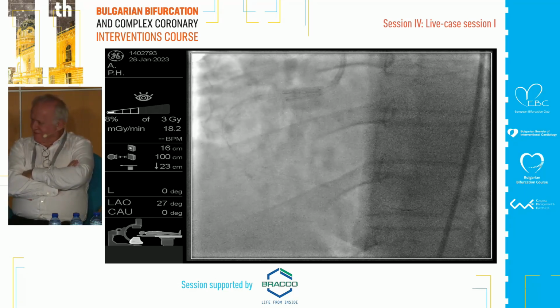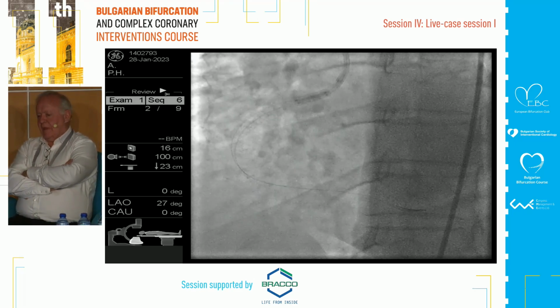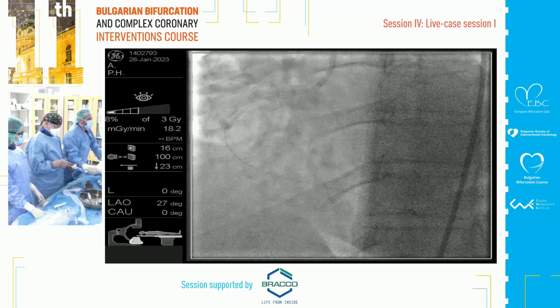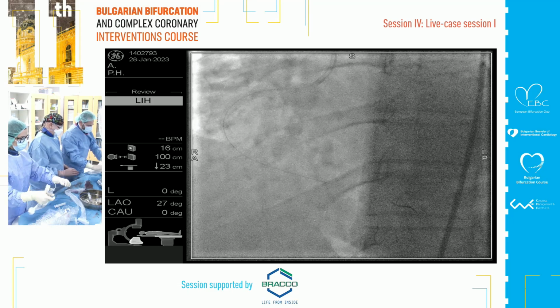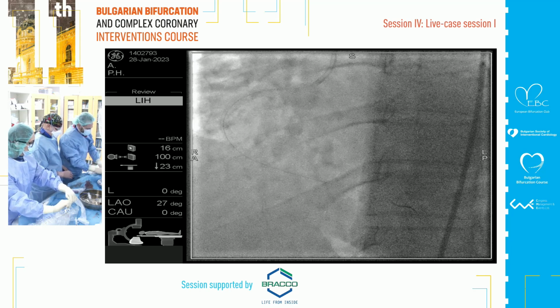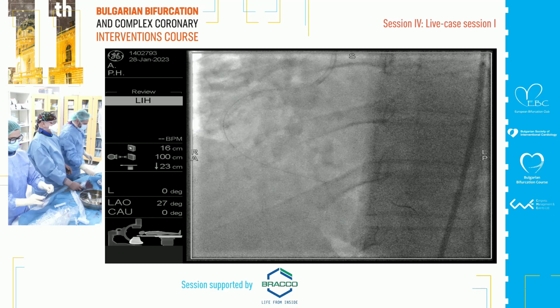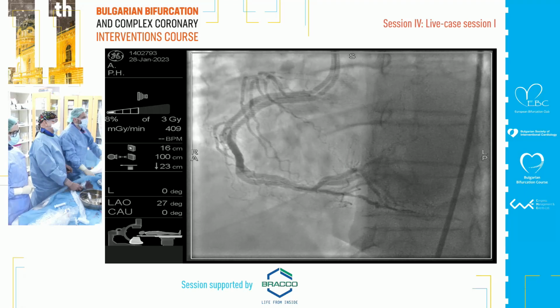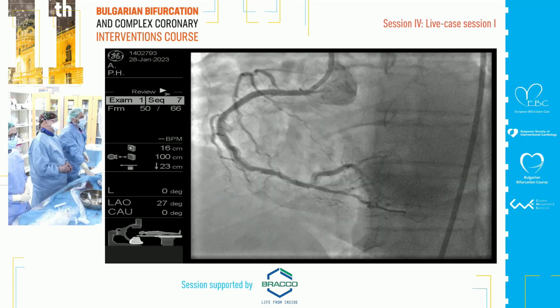So he decided to pre-dilate. You could have gone 12, and I don't like to leave a 1 millimeter gap. Yes, I think that's the risk. Gently withdraw the balloon, without seating the guide wire too deep, in order to not damage the ostial stent. Now you will be overlapping and post-dilating. Personally, I will keep this semi-compliant balloon inside the stent, because this is the best way to optimize the diameter if the vessel is open, which is not the case, but apparently the ostium is covered. Yeah, it's pretty good.